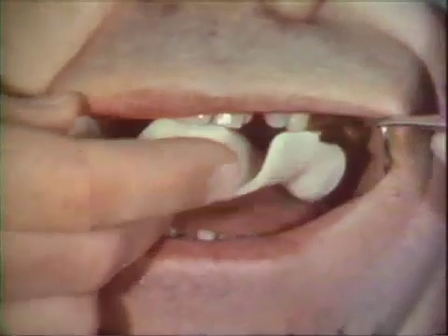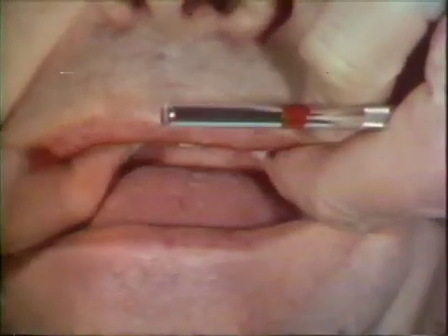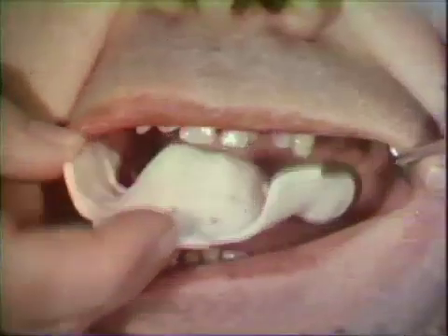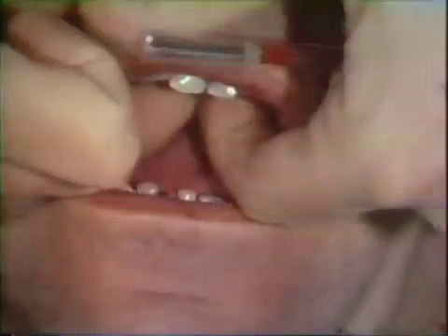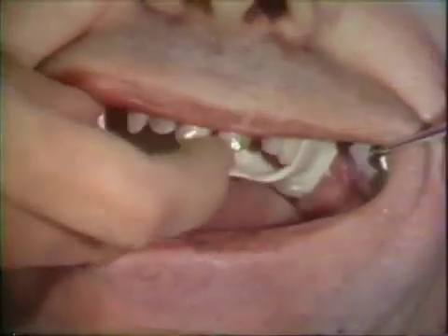The first step accomplished on the patient is redefining the borders with modeling compound. The initial areas molded are the retrozygomatic spaces, done on one side at a time. After one side has been completed, compound is added to the opposite side. The patient is asked to move his jaw from side to side. As the coronoid process comes forward, it develops the details of the area on the impression trays.